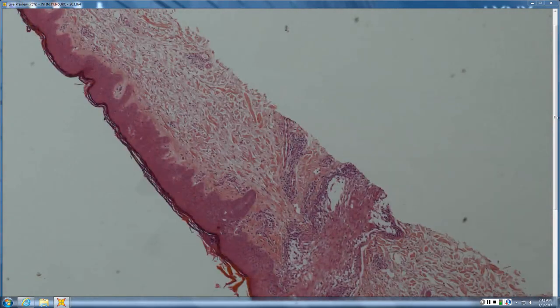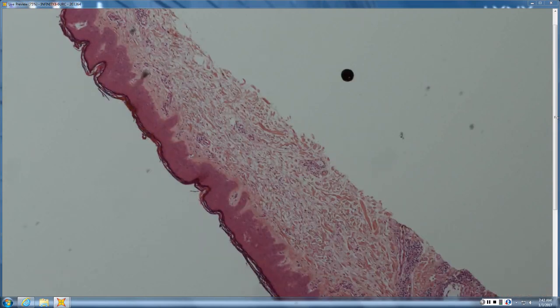So this is either a spongiotic folliculitis, like a disseminate and recurrent infundibular folliculitis. Who gets that? Young black guys, typically. And it's a distinct cut off where they go from normal skin to this skin that's like goose flesh, and the goose flesh shows just spongiotic infundibular folliculitis. And then the other question would be alopecia mucinosa. Spongiotic folliculitis can have some mucin in it, so that can be a problematic call sometimes, but that's definitely your differential.